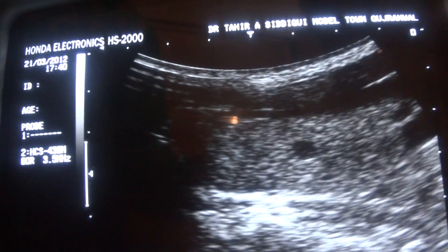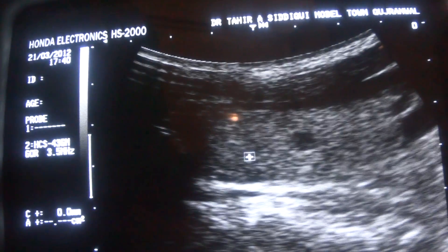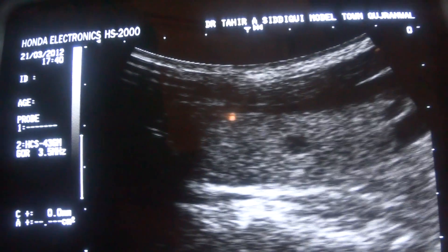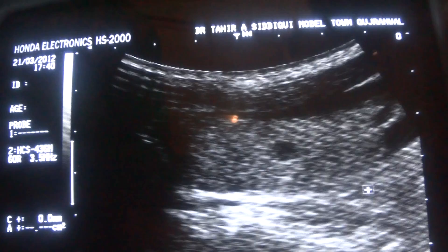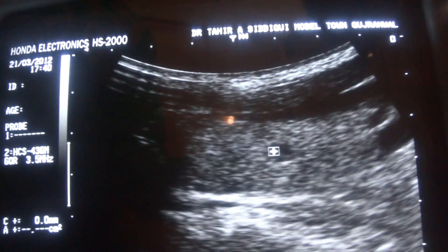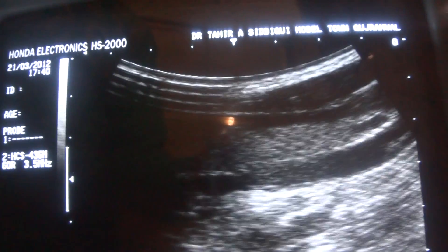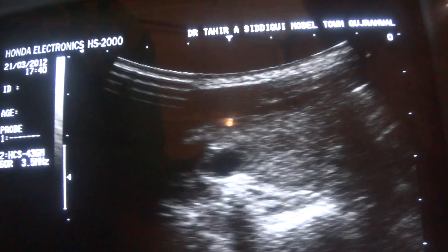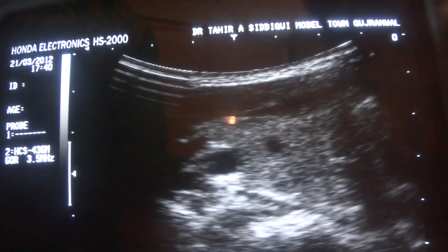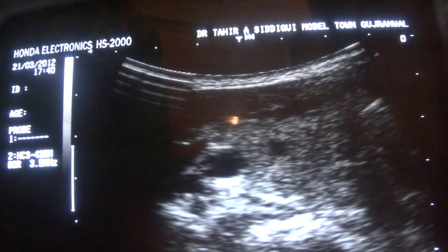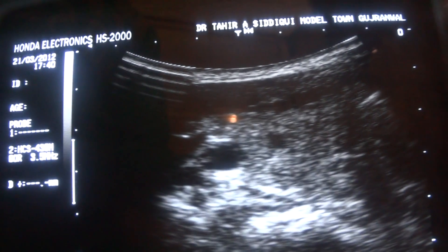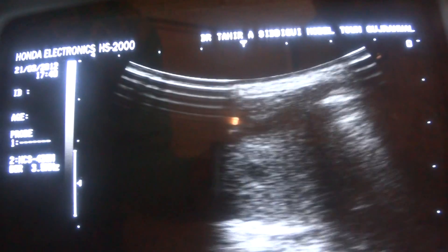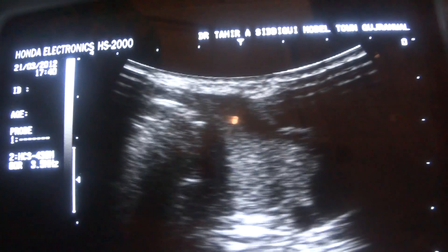This is the longitudinal section of the thyroid lobe. In longitudinal section, this is the common carotid artery and this is the parathyroid gland. And this is the parathyroid gland in transverse section, seen here in the right lobe and the left lobe of the thyroid.